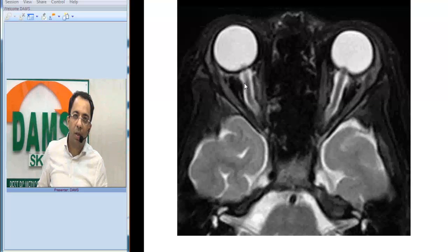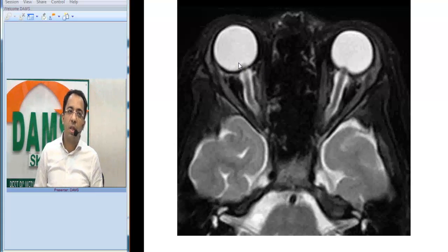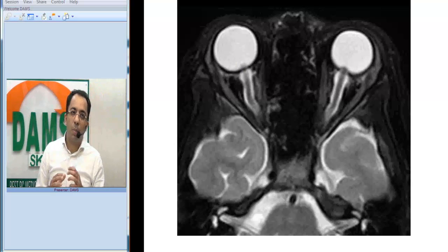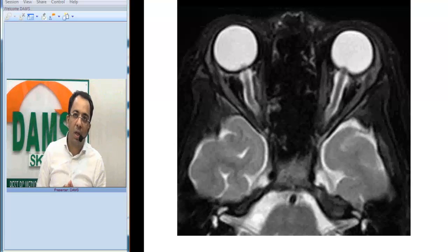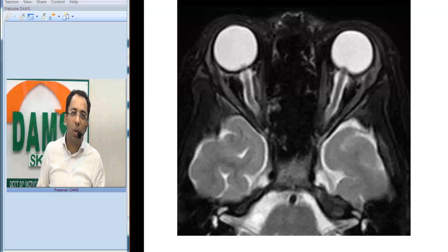If you look at the optic nerves, the optic nerve sheath — the fluid around the optic nerve sheath looks prominent and tortuous. And if you see the optic nerve head, it looks slightly protruding into the globe. So the findings are: a tortuous optic nerve complex with prominent nerve sheath fluid and bulging of the nerve head into the globe.